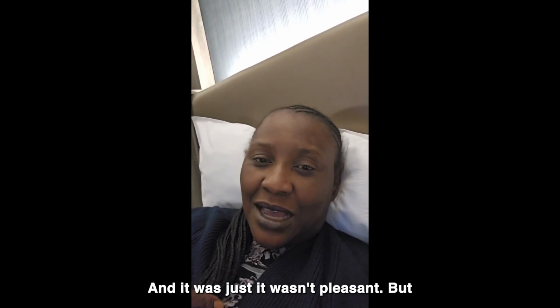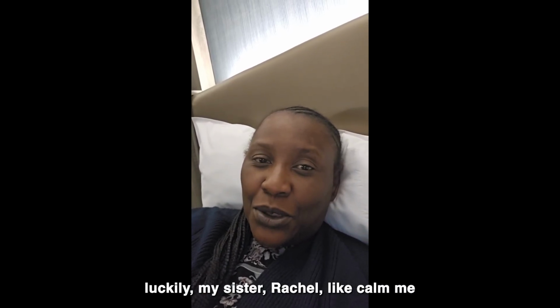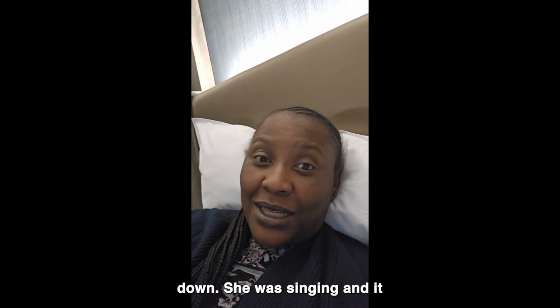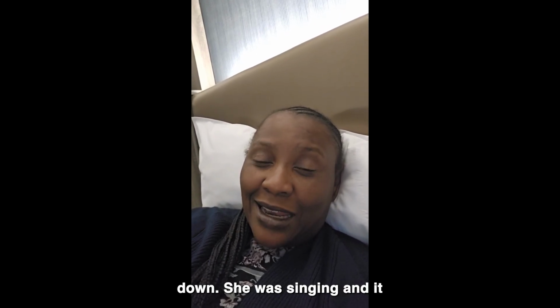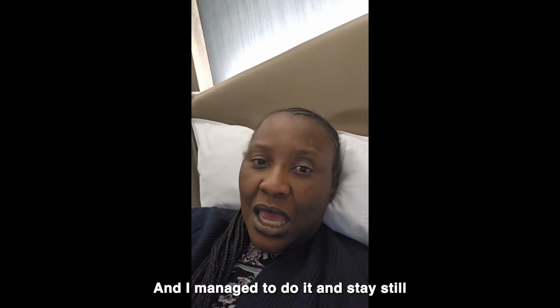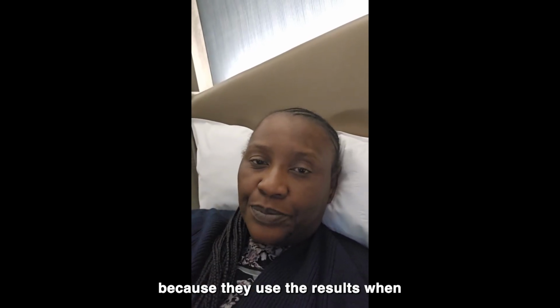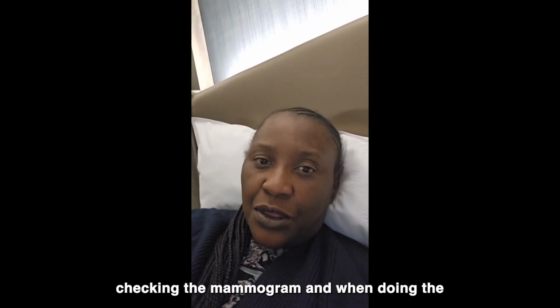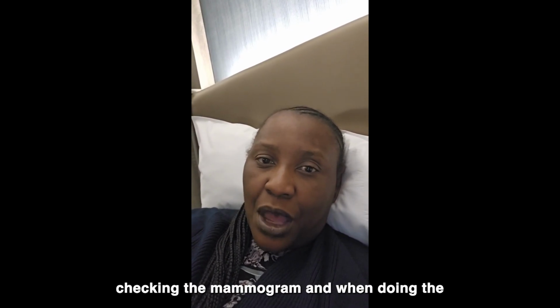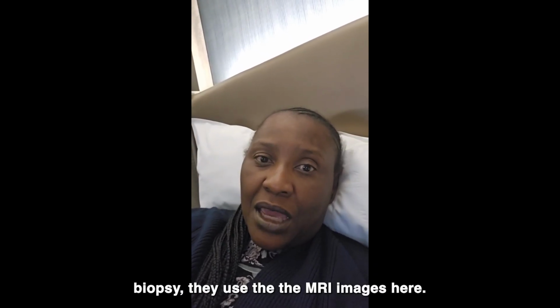It wasn't pleasant, but luckily my sister, Rachel, calmed me down. She was singing, and it was so relaxing for me, and I managed to do it and stay still, because they used the results when checking the mammogram, and when doing the biopsy they used the MRI images here.